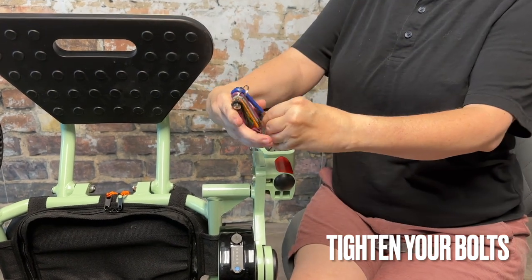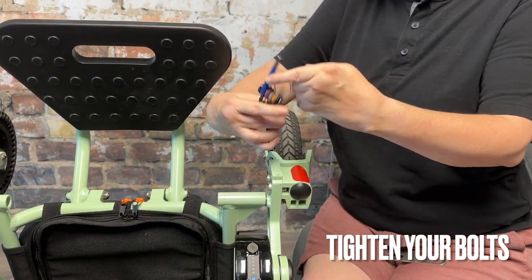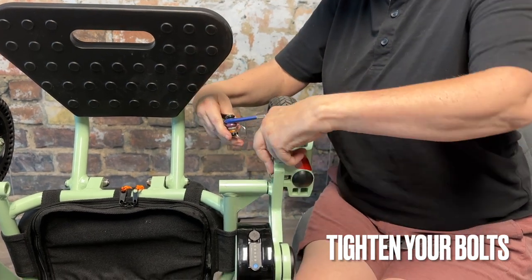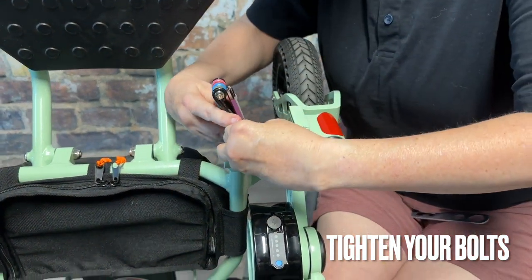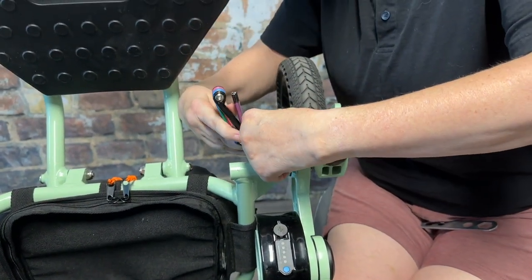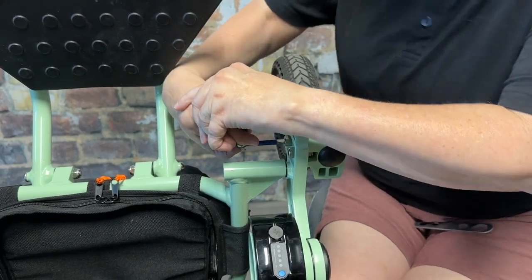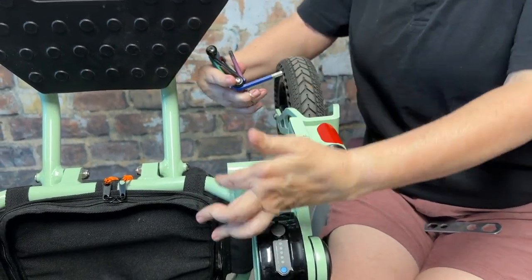Now we're going to take our tool kit. We are going to start with the blue colored hex bolt — the two bolts that hold the front wheel onto the chair. Stick the end of the allen head into the top of the bolt. Righty tighty, lefty loosey.